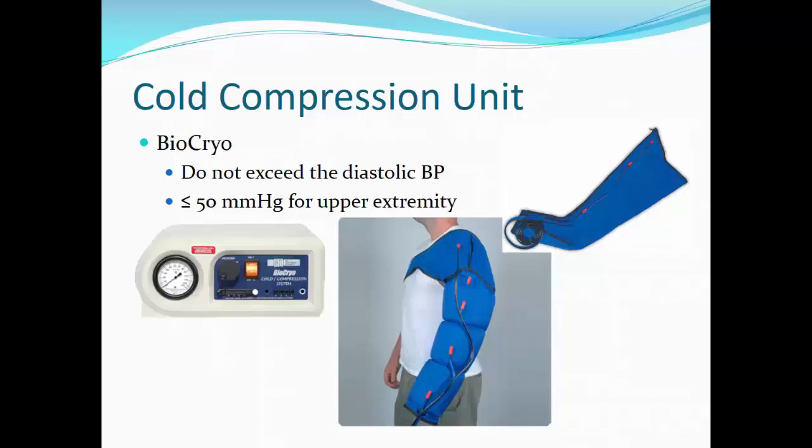Remember, all attachments must be kept in a freezer as well, which makes this cold compression unit impractical for traveling as access to freezers is not usually readily available. In addition, the repetitive use with many patients requires multiple sleeves and may require the purchase of more than one unit.